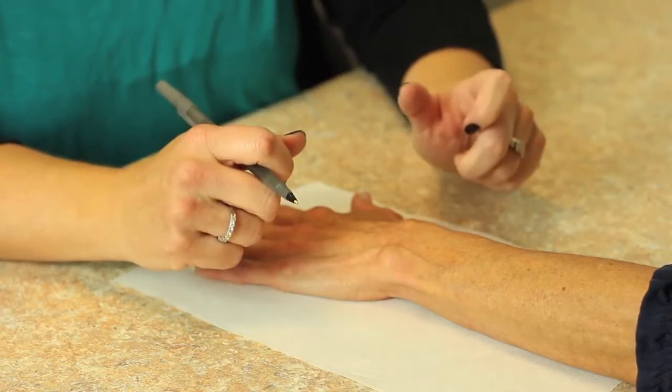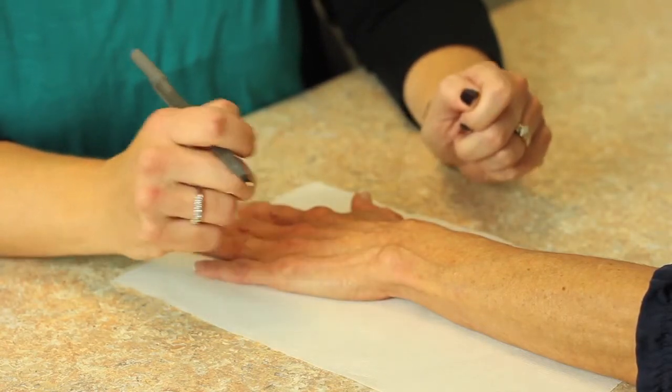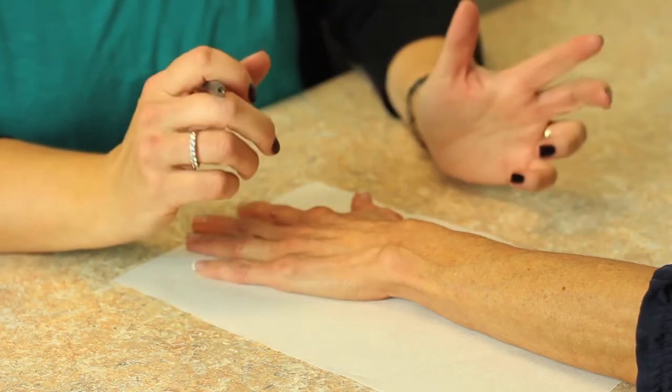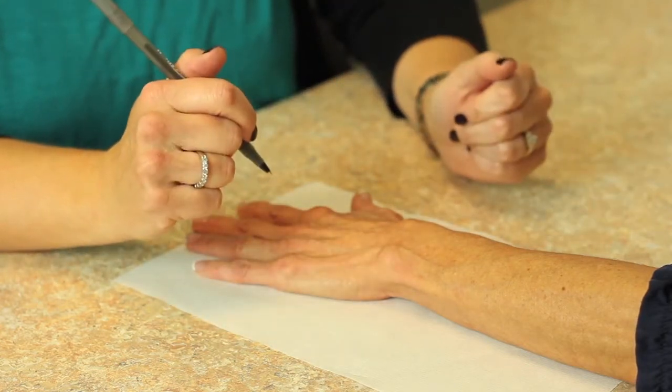In some cases you want to use the other side. If they've had an injury and they're not able to put their hand on the table like this, you can use their non-injured side to create the pattern.